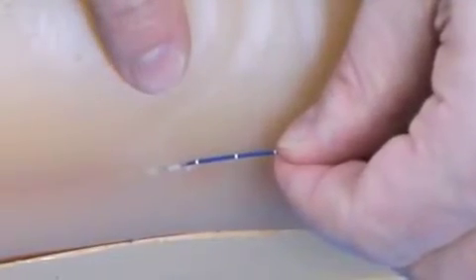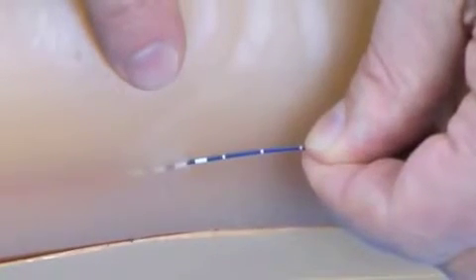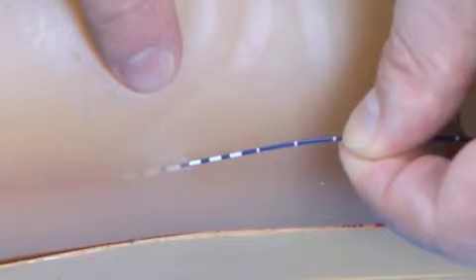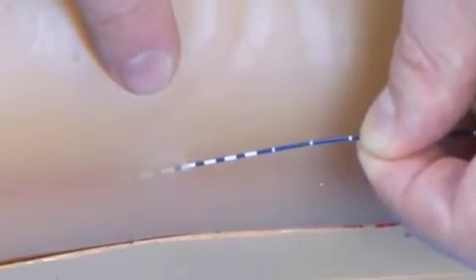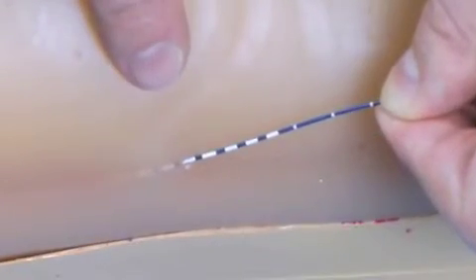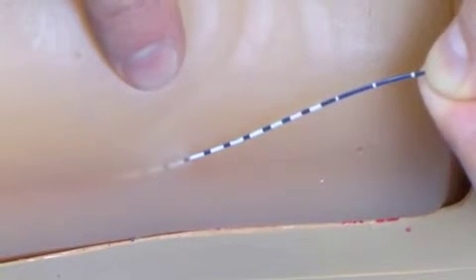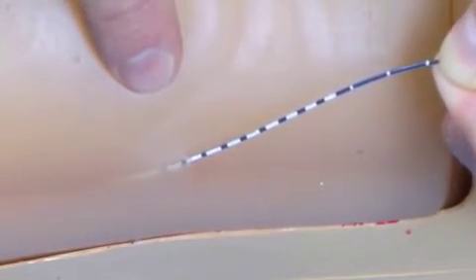As we're doing our pullback, we'll get near the end, and we'll be warned about this, because we'll start seeing the large white marks coming, and we know we're in the few centimetres at the end. In a normal-sized patient, or one where the vein is only a centimetre or so deep to the skin, we'll keep on pulling back and keep treating right up until these white marks become confluent. In a larger patient, or a patient in whom the vein is deeper, we may elect to stop earlier, making sure that we're not putting the fibre through any fat tissue, and making sure that the treatment is restricted to the vein only.